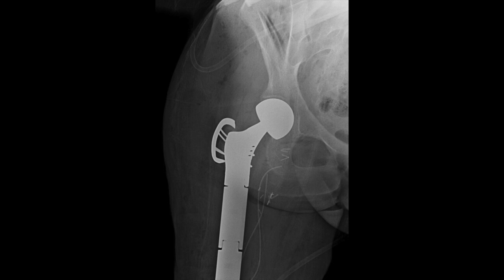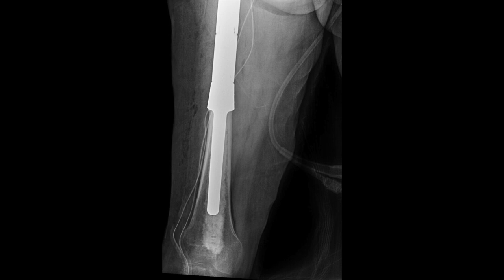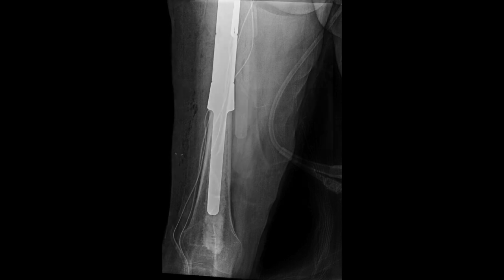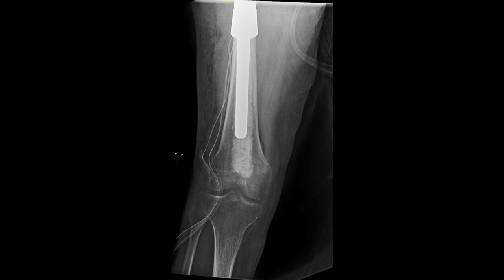Post-operatively, the patient will continue monitoring with routine imaging and wearing a low-profile hip abduction brace. She was cleared to resume chemotherapy for Ewing sarcoma two weeks after undergoing the procedure.